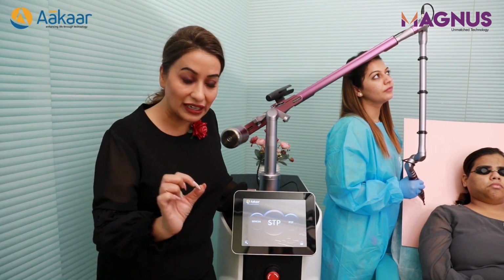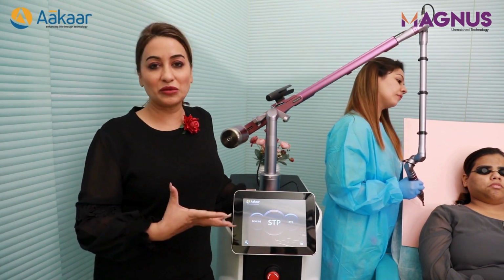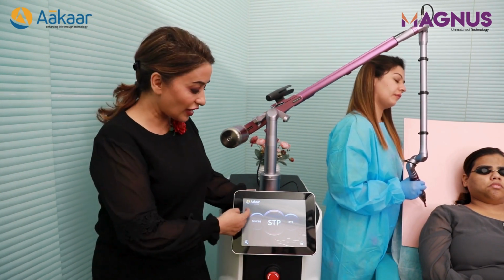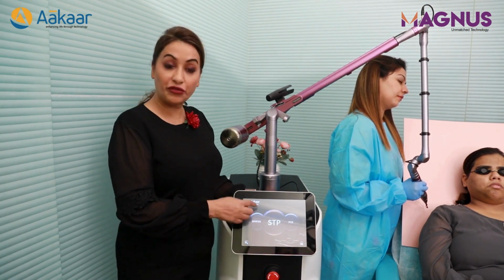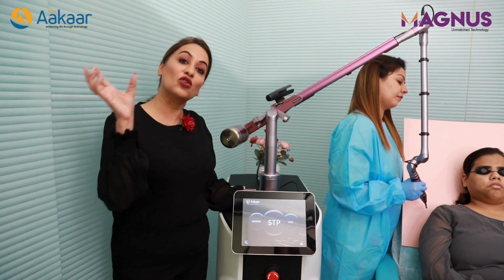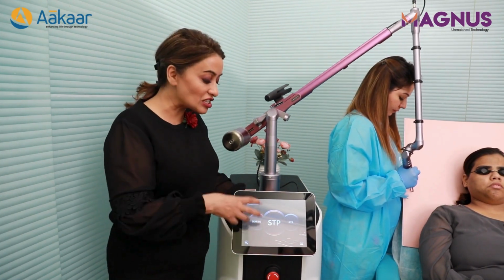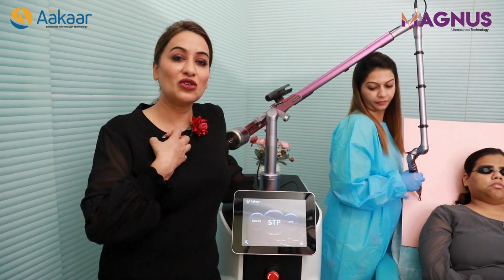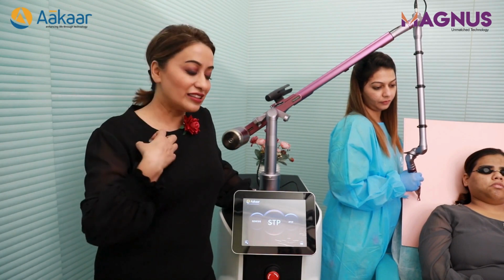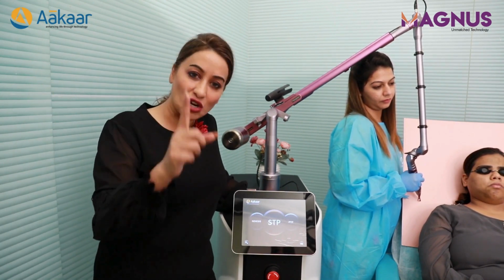But what is special about Genesis is that there is no other technology as such which I get in microseconds where I can actually work on the collagen, right? As dermatologists, we keep talking about collagen rejuvenation. So here I get 300 microseconds, and going back to selective photothermolysis, it is very important that the machine you choose has the right parameters. Otherwise, as a dermatologist, this is my tool to deliver results to my patients. So you have to choose your tool well.